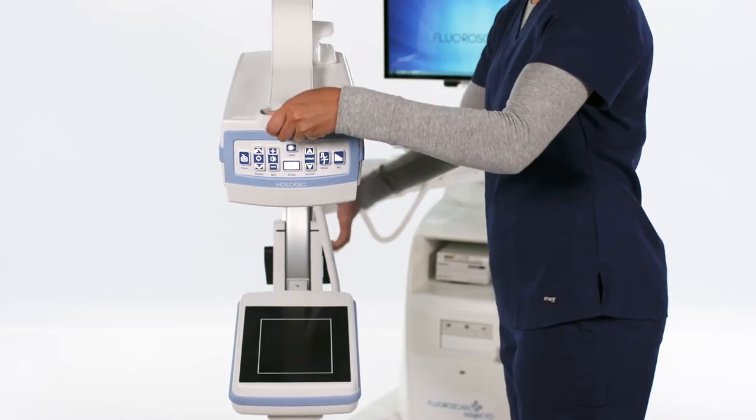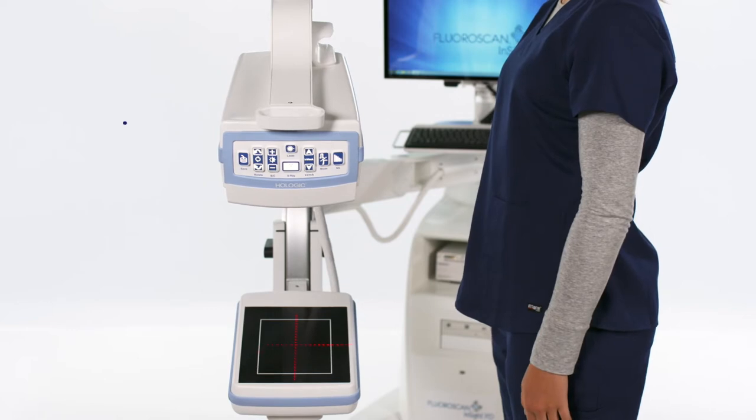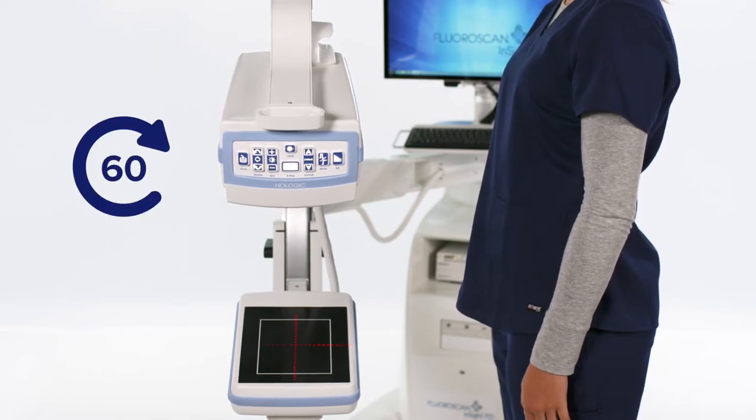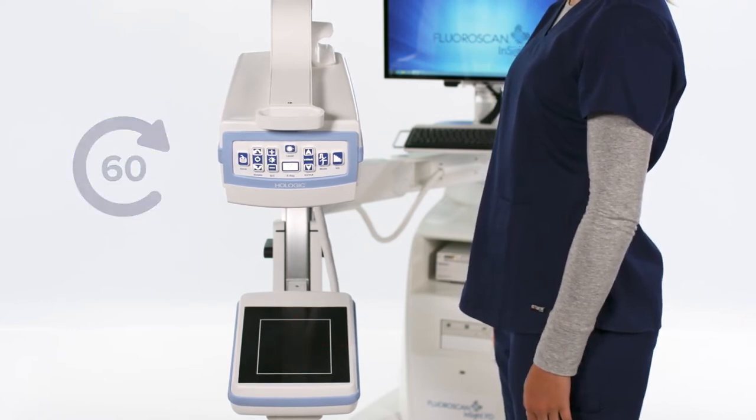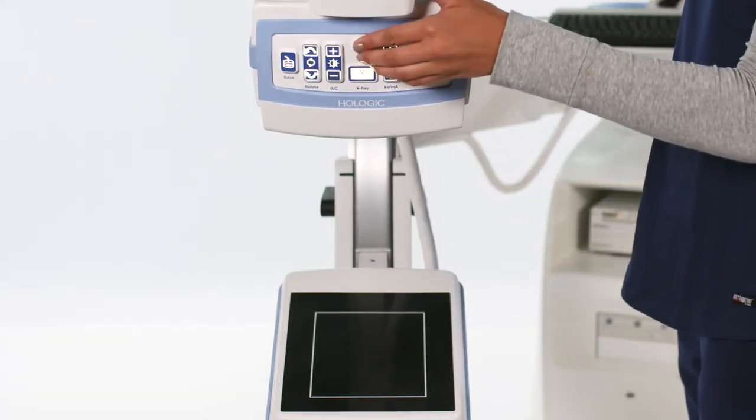To turn on the laser, press the laser button. It will automatically shut off after 60 seconds. To keep the laser on, hold the button for about two seconds.